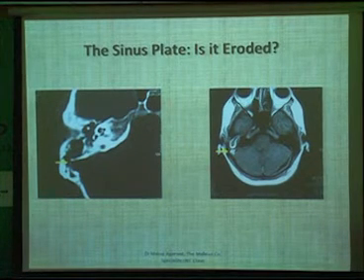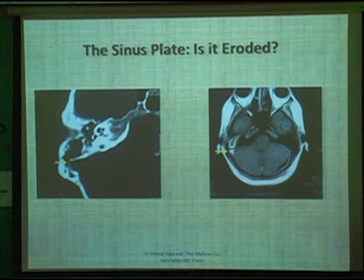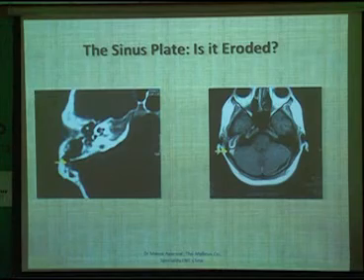The sigmoid sinus lies right behind the sinus plate in the mastoid part of the temporal bone. Any break in the bone over the sinus plate area should always warn the radiologist and otologist about the probability of intracranial complication — either in the form of lateral sinus thrombosis, perisinus abscess, or even a cerebellar abscess. The MRI confirms this: the pathology is seen in the middle ear and mastoid area, and a hyperintense signal within the sigmoid sinus suggests lateral sinus thrombosis.